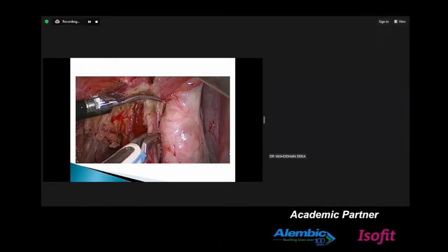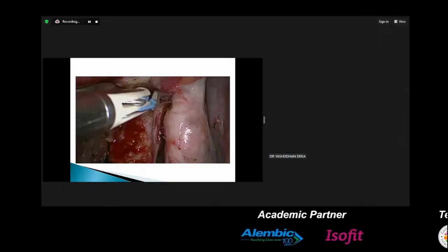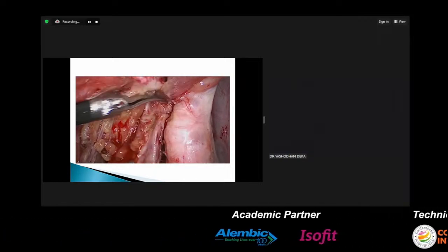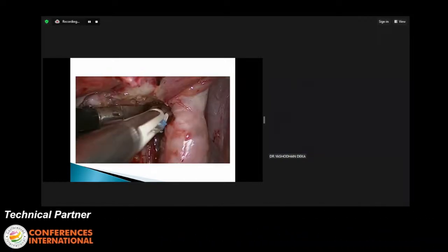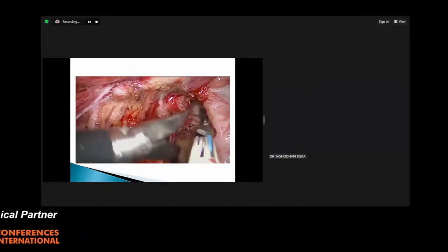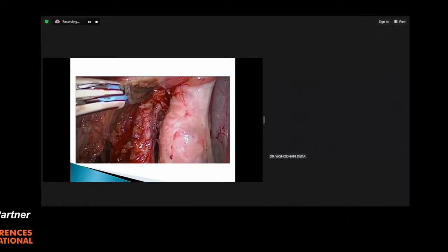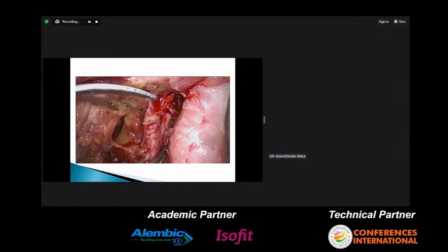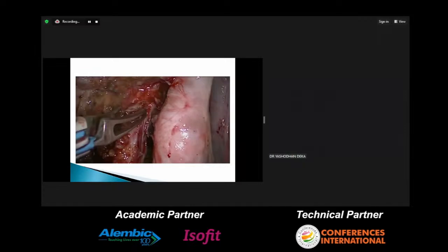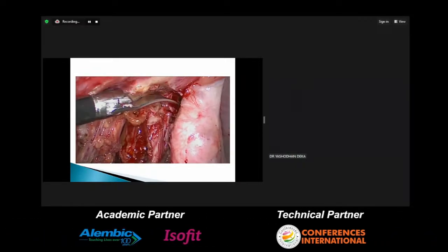Okay. So as you can see now, this is where we are approaching the nodular part here. So stay flush, flush, flush. The uterus is acutely anteverted with a vaginal manipulator, and we usually suspend both the ovaries on the side. Now with your pararectal space dissected, you are only left with the nodular part in the center. That is the importance of doing a pararectal space dissection. Then get a nice pull on the bowel, get one of your assistants to give a cephalic traction to the bowel, and just give small nips and proceed millimeter by millimeter with a slight buzz, because this is the nodular area.